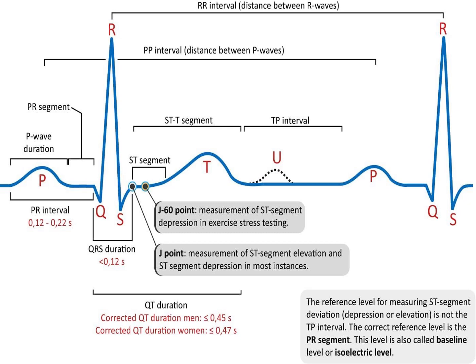Today we're going to continue the cardiac theme and we're going to talk about lead 2 interpretation. A lot of people have trouble looking at ECGs, understanding what it is, so it's my hope to maybe shed some light into what to look for and what's actually happening with the heart. Because it's all well and good being able to read an ECG, but if you don't know what's happening in the heart and what to do about it, then it's kind of pointless.